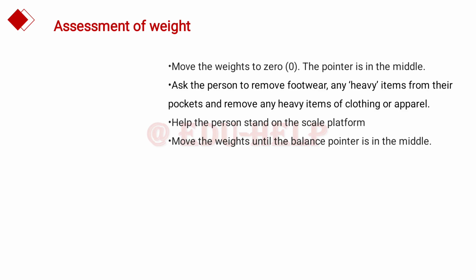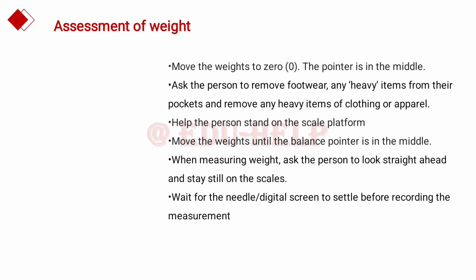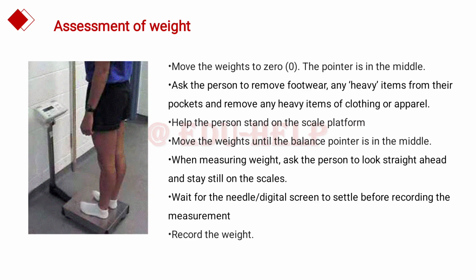These are the steps of assessment of weight. We should move the weight to 0, or the pointer of the weighing scale should be in the middle. Ask the person to remove footwear, any kind of heavy item from their pockets, and any kind of heavy clothing. Ask the person to stand on the scale and move the weight until the balancer point is in the middle. While measuring weight, ask the person to look straight ahead and stay still on the scale. Then we should wait for the needle or the digital screen to settle before recording the measurement. We should record the measurement twice, and the average value should be taken into consideration.